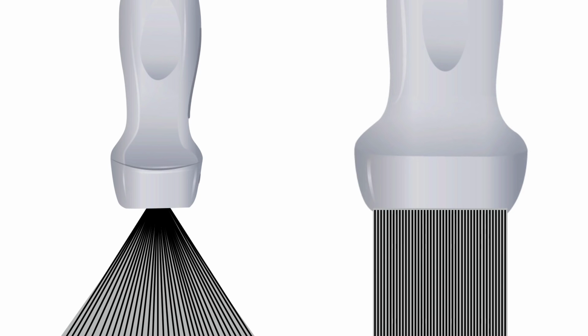This produces a greater lateral resolution. Whereas you see in the phased array, the lines of sight are very close together near the probe but very far apart as they splay further outwards deeper into the image, reducing your lateral resolution deeper into the view.